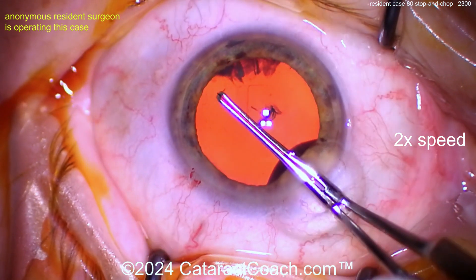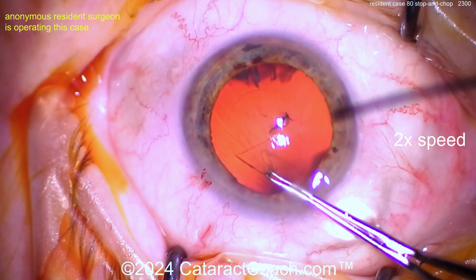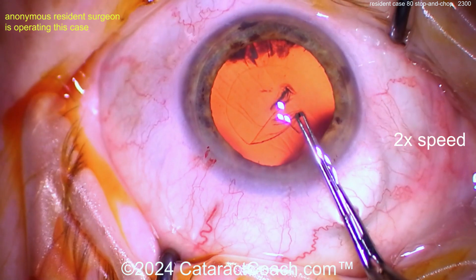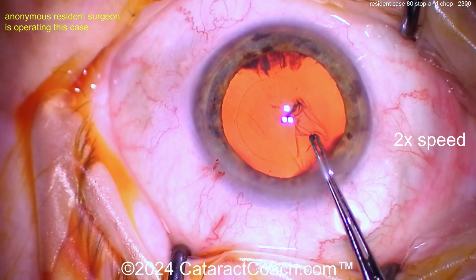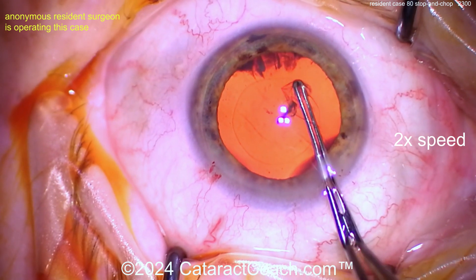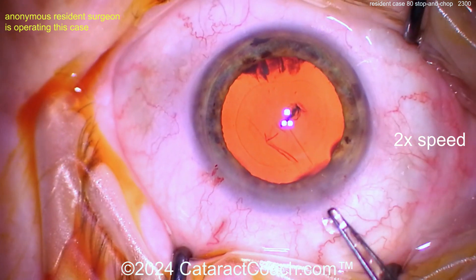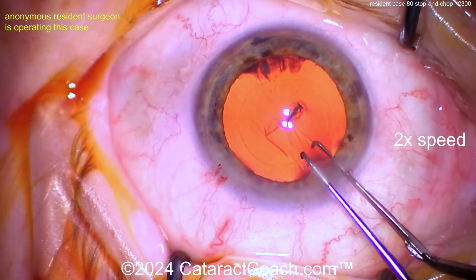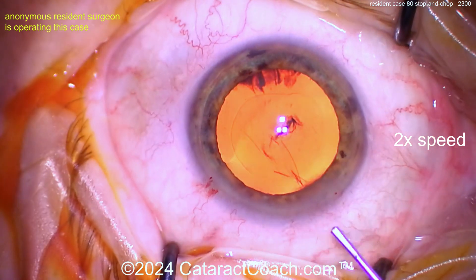Now going with the specialized forceps, grabbing that — rhexis done: one grab, two grabs. Be careful — those rhexis danger zones. If you're a young resident watching this, go to cataractcoach.com and search for 'danger zones' — there's a whole video about rhexis danger zones you should definitely know.